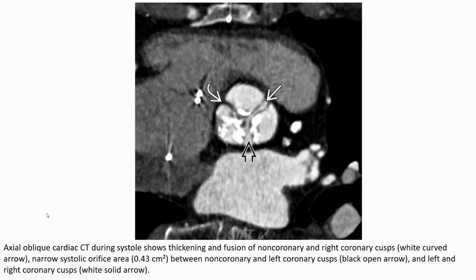This axial oblique image shows thickening and fusion of the non-coronary and right coronary cusp, with a narrow systolic orifice area of approximately 0.46 cm² between the non-coronary and left coronary cusp, and between the left and right coronary cusp.